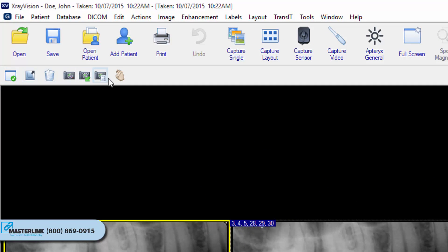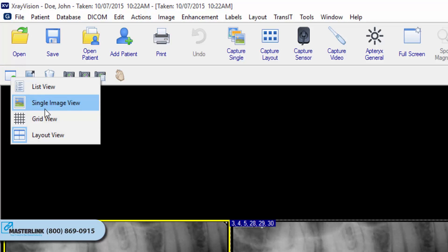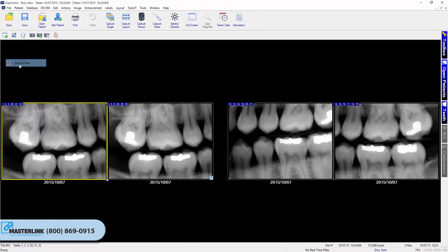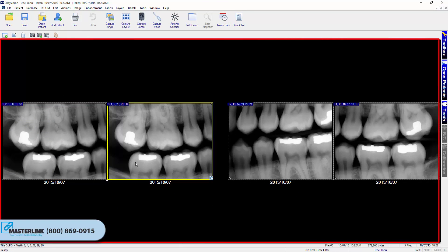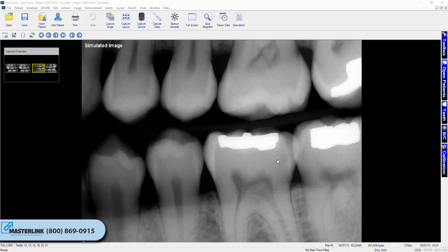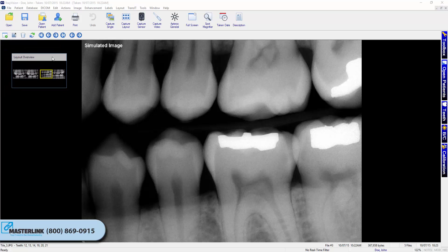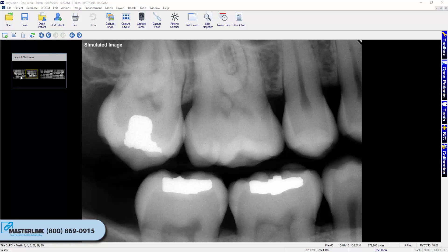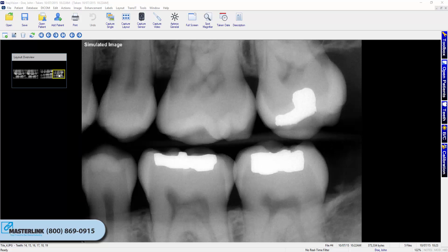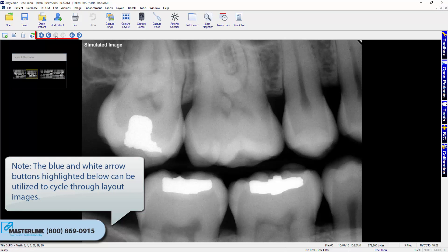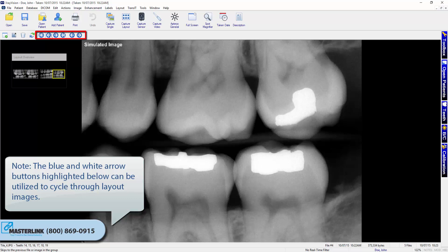There are several different ways to view layouts in x-ray vision. The Select Group View button allows the user to change the viewing mode of layout images. The layout view is the default layout viewing mode, where all images in the layout are displayed in their anatomical positions. Double clicking on an image in layout view will open it in single image view, and the entire layout is then displayed in a small floating layout overview window, allowing the user to easily switch between images in the layout.